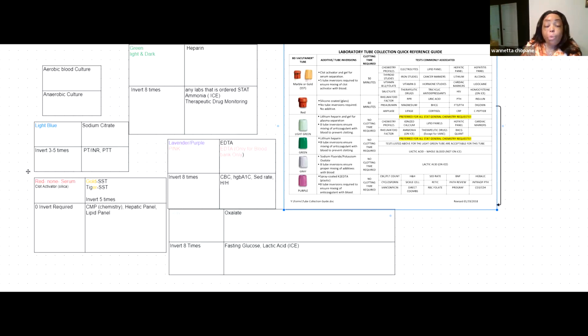So our serum tubes, which is next in the order of draw after the light blue top tubes, are clotted tubes. They are made to clot, okay? You got your red top tube with no additive, but you got your marble and gold top tube, which is what you're going to see in real life and you're going to use, okay? You don't just automatically pick up the red top tube. Everybody just pick up the gold or the marble, okay? Those are SST tubes, serum separator tubes.